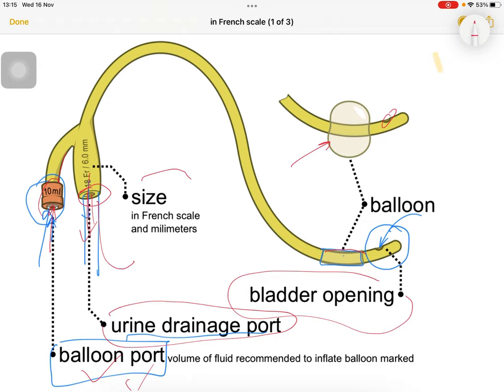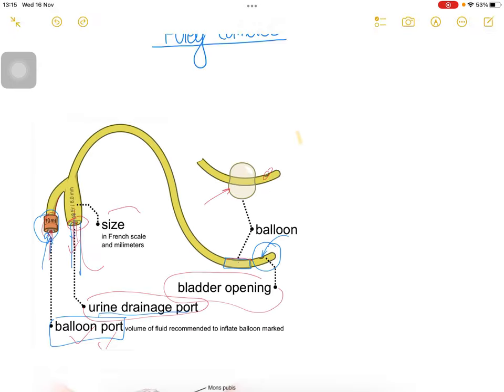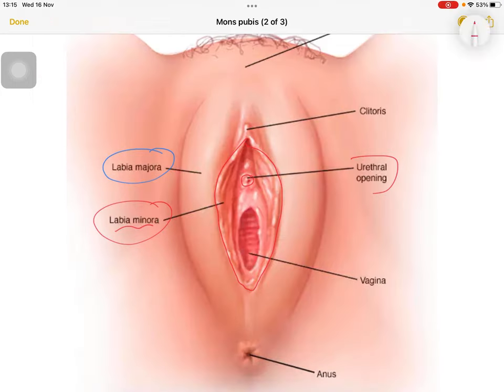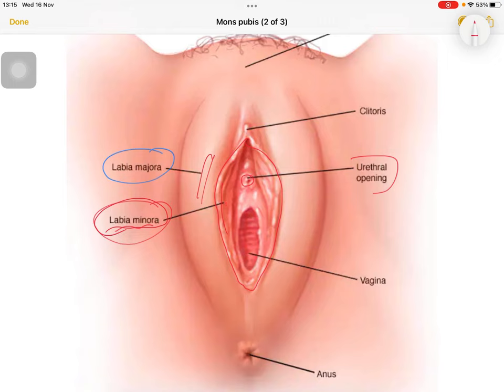For the anatomy, we need to know about the labia majora and labia minora. We have to retract the labia minora to insert the Foley — by retracting the labia minora and exposing the urethra and the vagina, then we insert through the urethral opening.